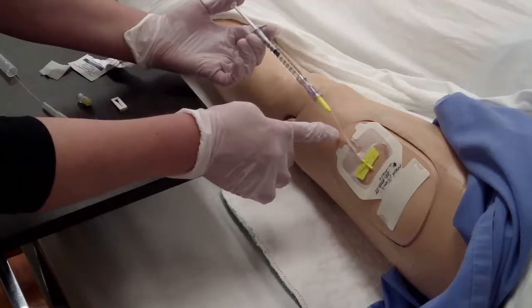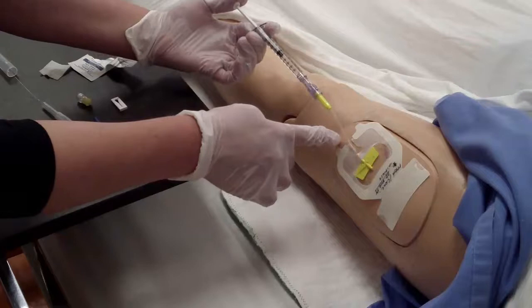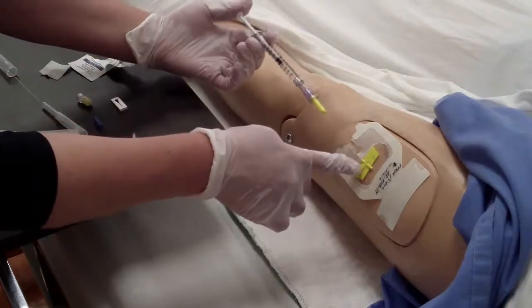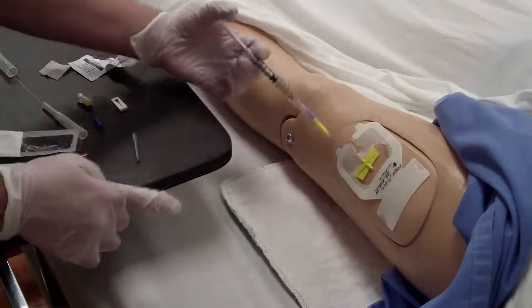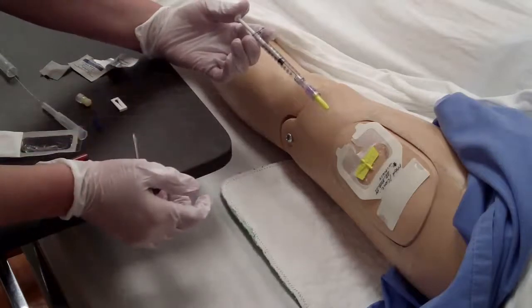There can be some discomfort when you are injecting medication, so ensure that you inject slowly. If you do notice any bleeding, leaking, or a bleb forms at the insertion site, you will need to stop, remove the system, and start again.